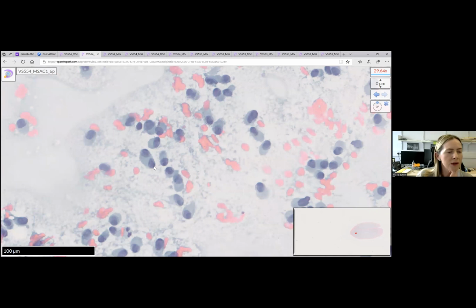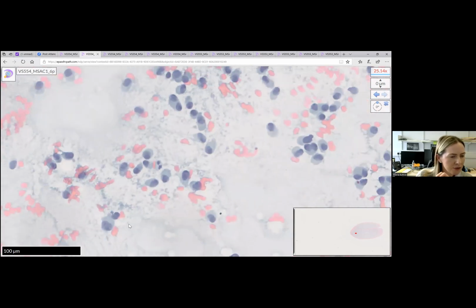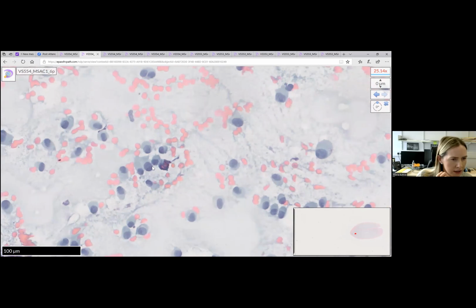So more of a greater degree of nuclear pleomorphism, cytoplasmic vacuolations, and these are not features that are seen in these direct spread preparations. What we do see are singly dispersed atypical plasmacytoid cells, they have eccentric nuclei, they have high NC ratios and prominent nucleoli. I was trying to see if I could find a nuclear inclusion, which I could earlier.